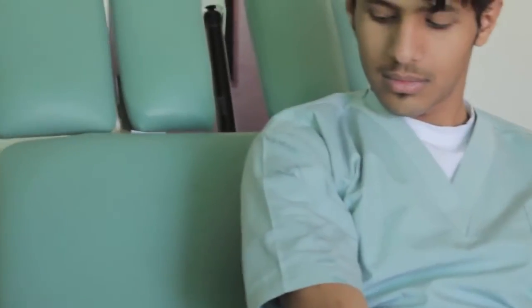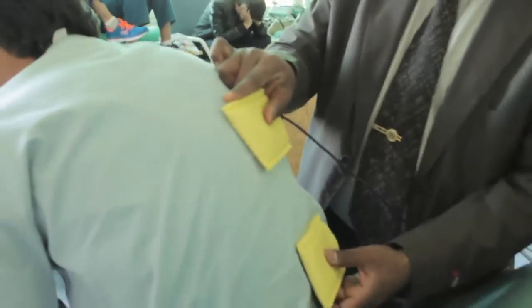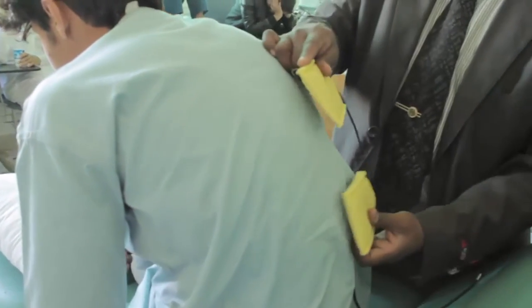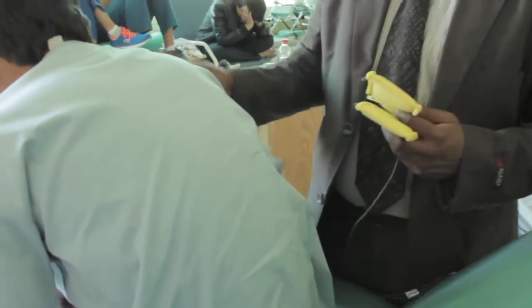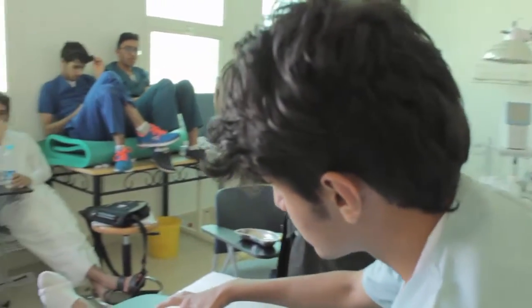Back muscles, when you want to strengthen the back muscles, directly this is the erector spinae. On the erector spinae, you can keep two electrodes. This side erector spinae or this side erector spinae. If you want both the sides stimulation simultaneously, it is called bilateral stimulation of the same group.